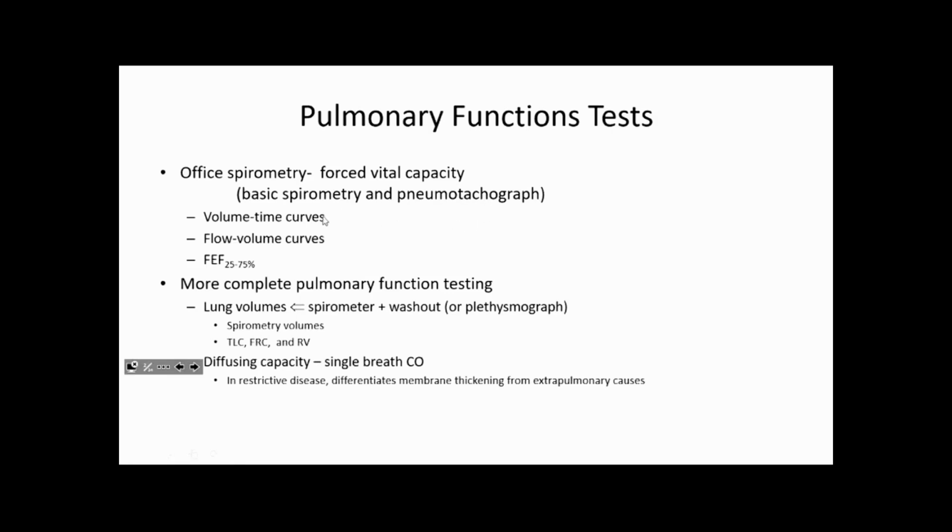The old-fashioned equipment is the spirometer itself. And sort of the more modern approach is to use a pneumotachograph. The spirometer is based on the principle simply of collecting volume over time in a big tank. The pneumotachograph makes use of a lot of the principles you learned first semester from Dr. Breshew about pressure drops. Pressure drop across the resistance will give you a measure of flow.